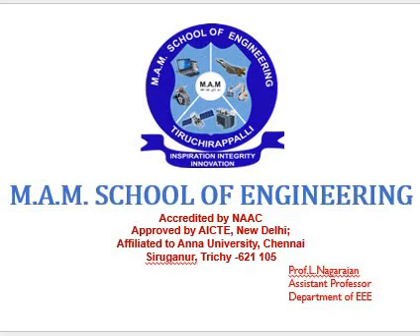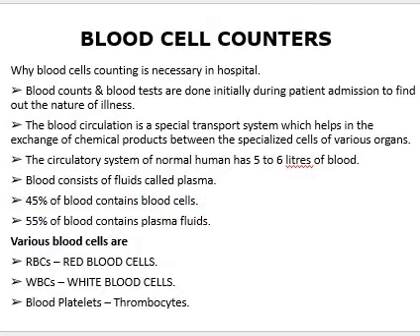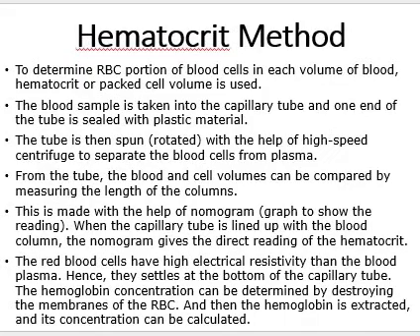Okay. So today we are going to discuss one of the blood cell counting techniques, that is the hematocrit technique. Okay, hematocrit method.